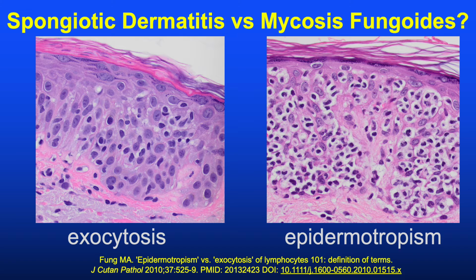Whereas in contrast, the neoplastic lymphocytes in mycosis fungoides are often described as being epidermotropic, or skin-homing T cells that are neoplastic, and histologically it's characterized by increased numbers of lymphocytes, often with exaggerated clearing or retraction or haloing around them. And cytologic atypia is expected with convoluted nuclear contours, but of course in practice that can be quite subjective.